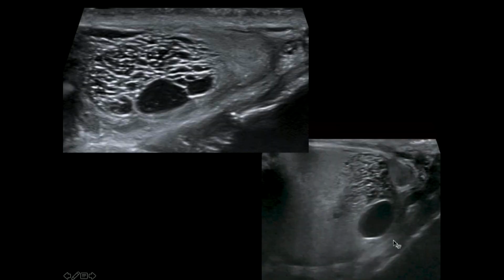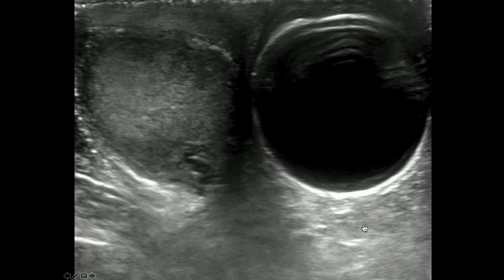And a couple times a year, you'll see the different variations there. So this is dilatation of the rete testis, and sometimes it just looks bigger and weirder than normal. But again, this looks like tubules that are dilated. There's no soft tissue component. There's no vascularity. It's in the mediastinum testis. If you haven't seen one of these, they're kind of unusual.